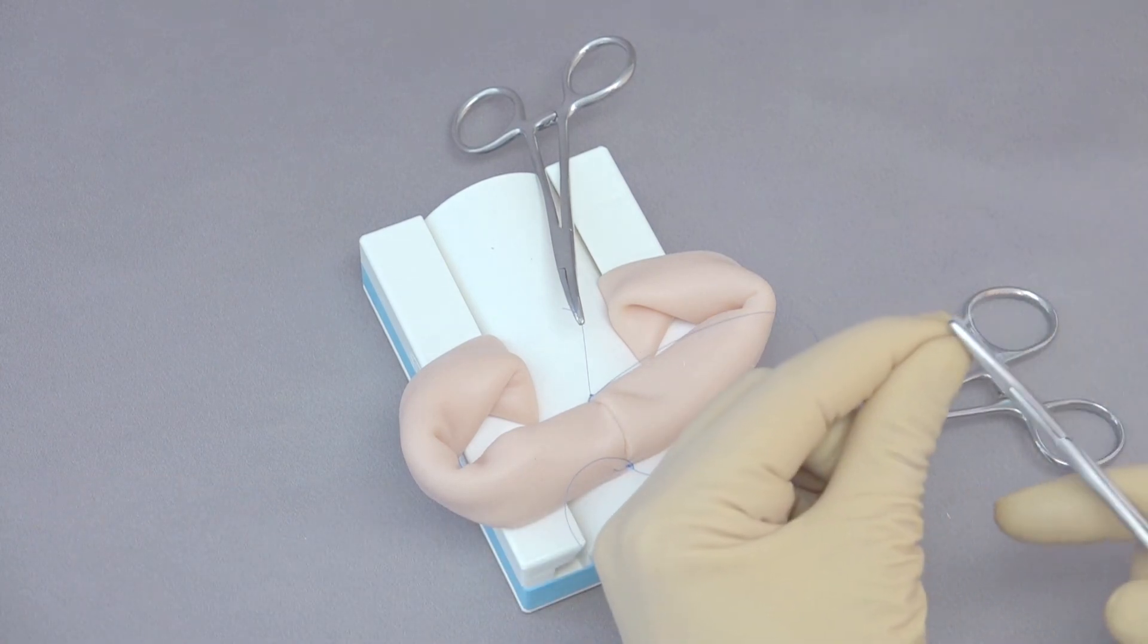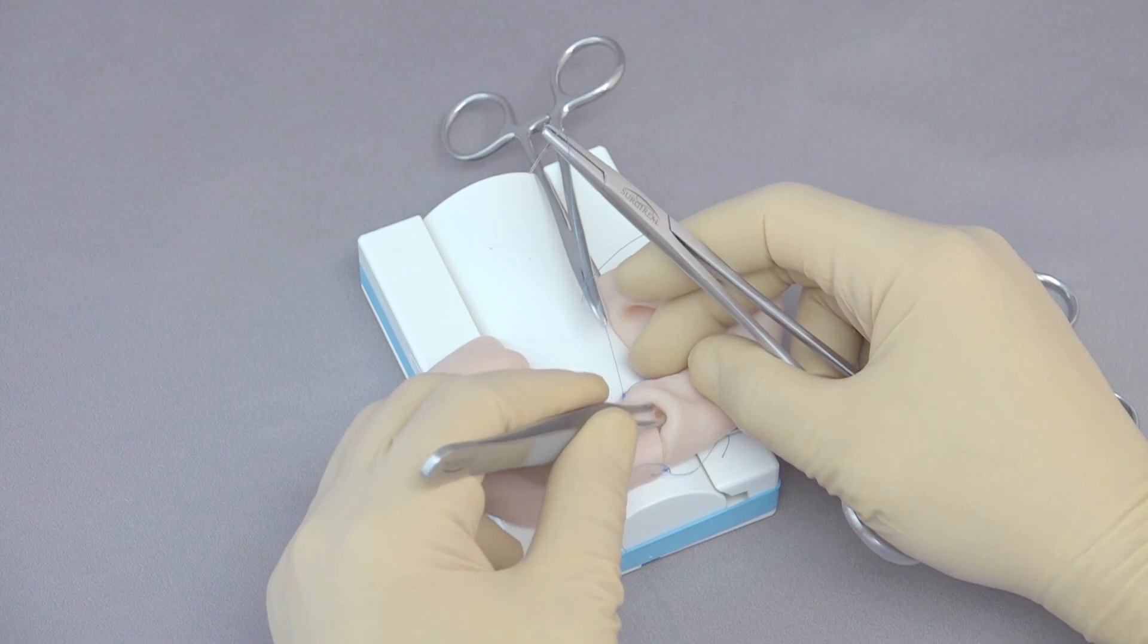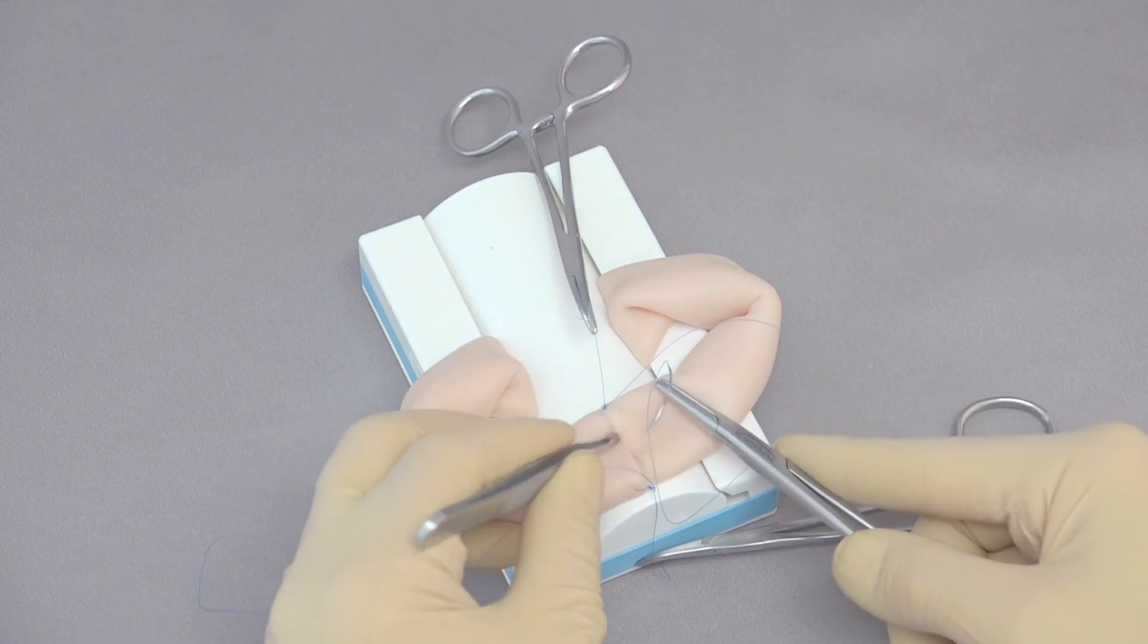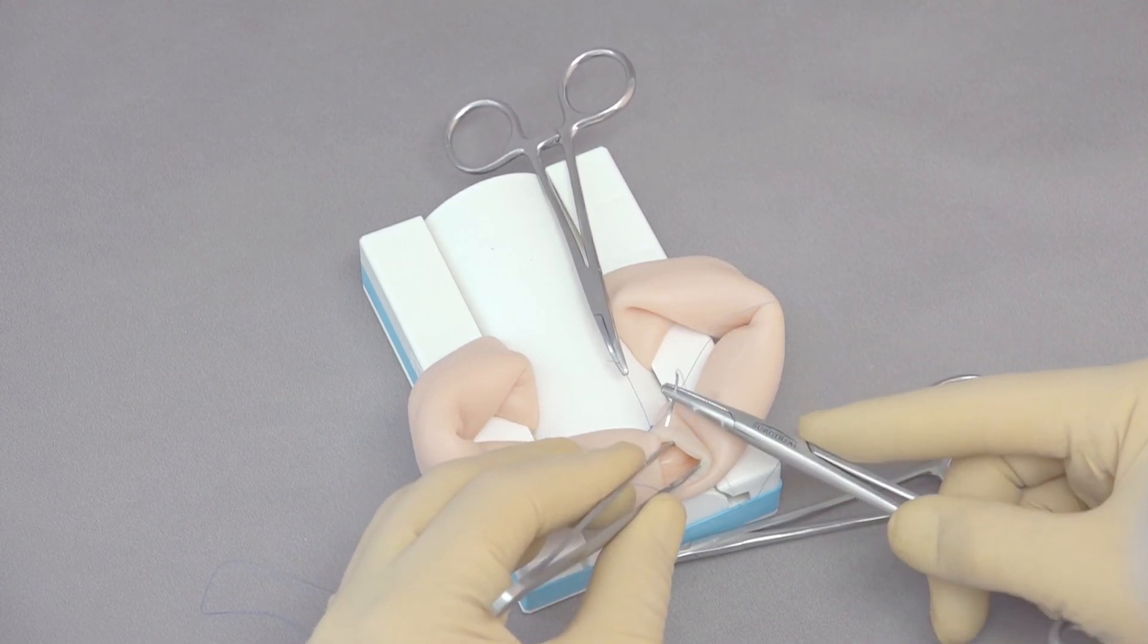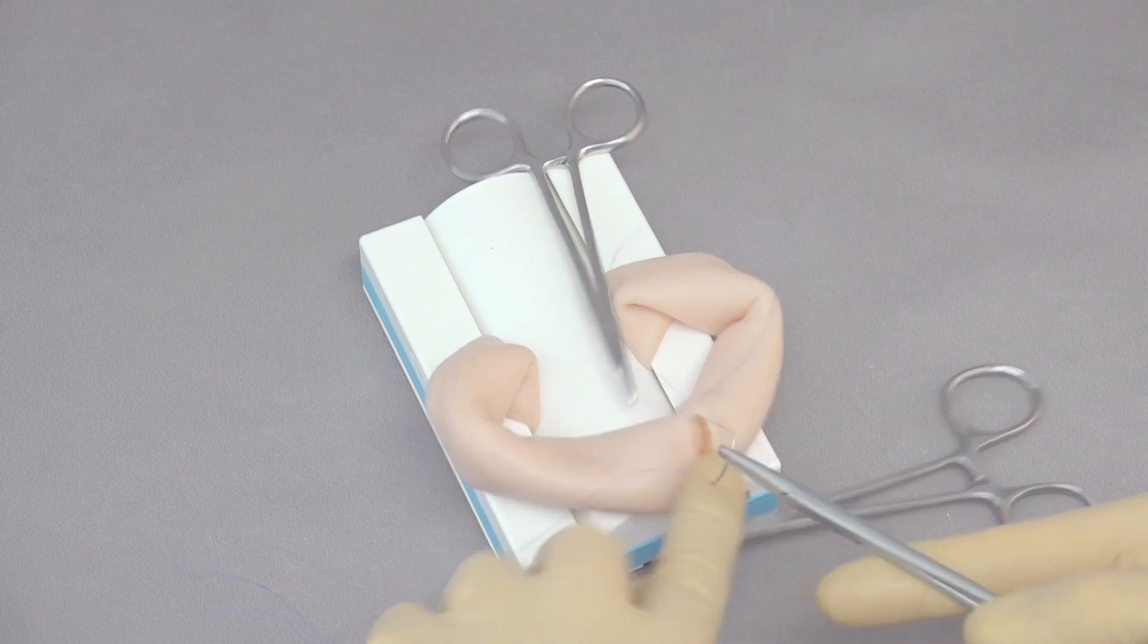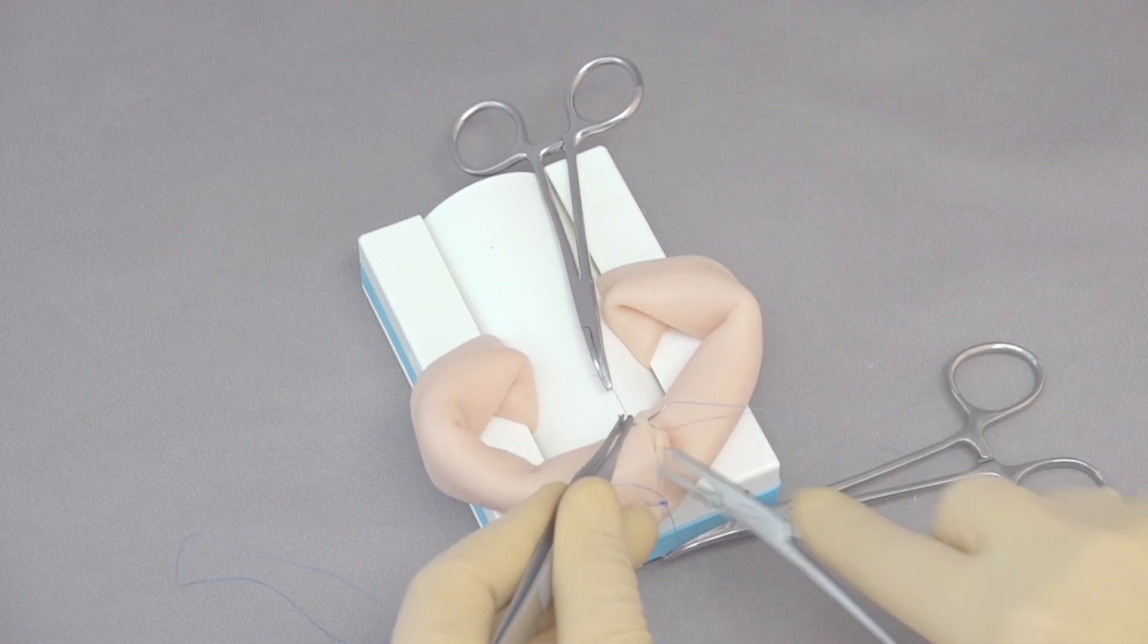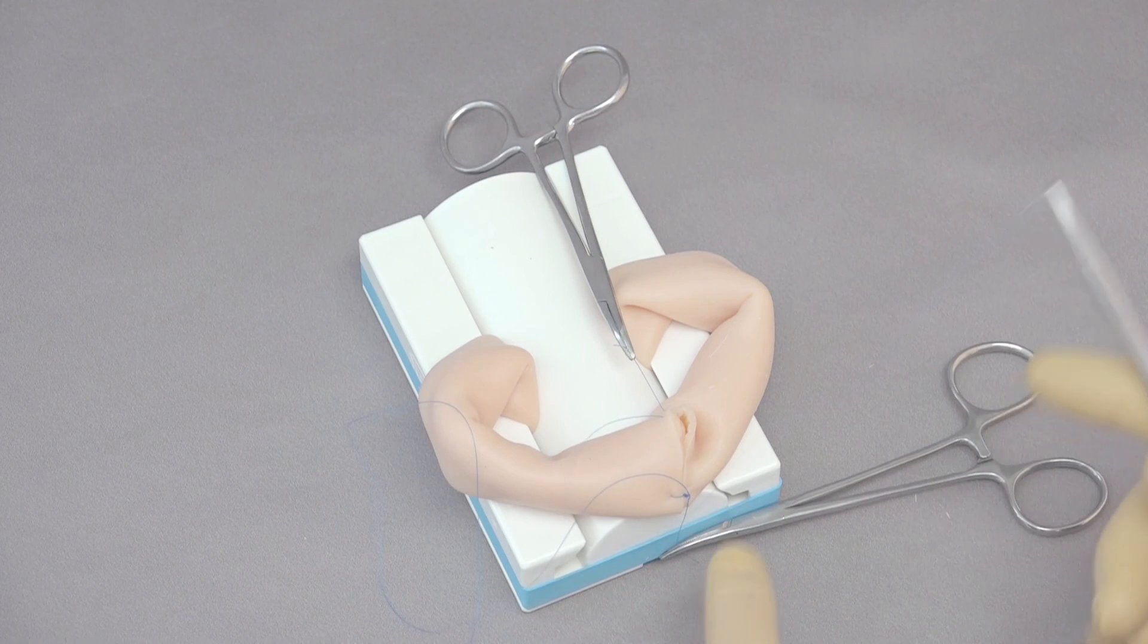So I take my first needle, use it with the needle holders, and now I'm going to work on closing this. It's very important not to close across the side of the intestine, otherwise you suture one side to the other and then it's closed. In this case what I'm going to do is I'm actually going to use my thumb forceps here to come into the lumen of the intestine so that I can make sure and not go all the way across. I'm going to go through from outside to in. Tighten that down. Again I can use my thumb forceps to stabilize the bowel, so I'm not actually grasping the bowel with my thumb forceps. And place that suture.